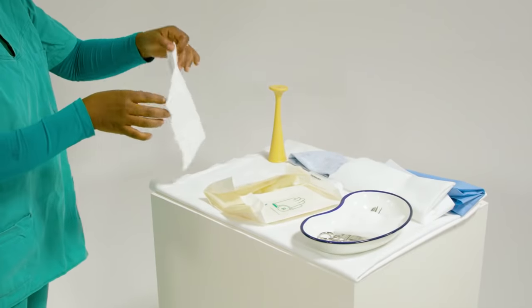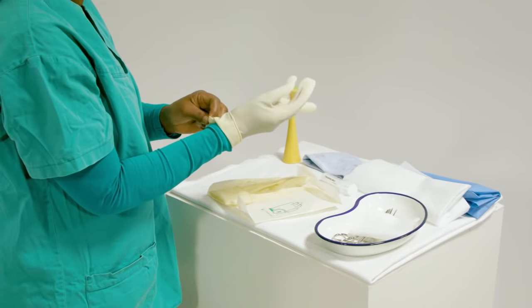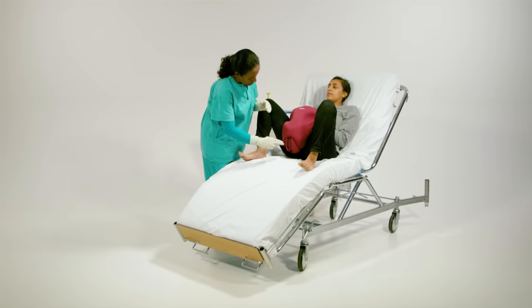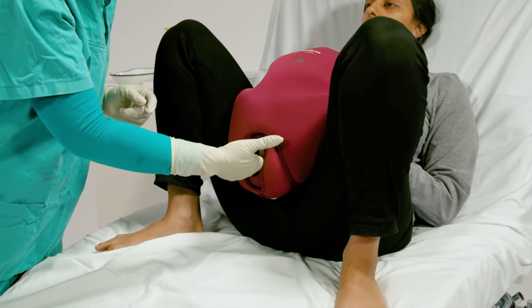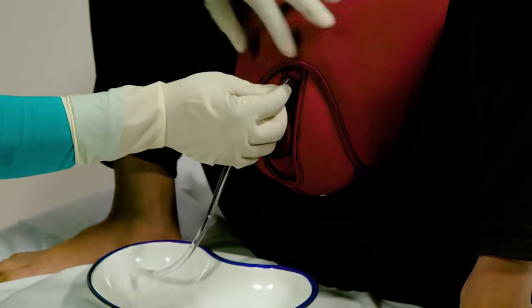The learner should now prepare for delivery. Wash hands and put on gloves. Explain to the mother what is happening and what you're going to do. Perform a vaginal examination and confirm that the criteria for vacuum assisted delivery are fulfilled — the baby is not coming out despite the mother's efforts. Catheterize the mother and empty the bladder.